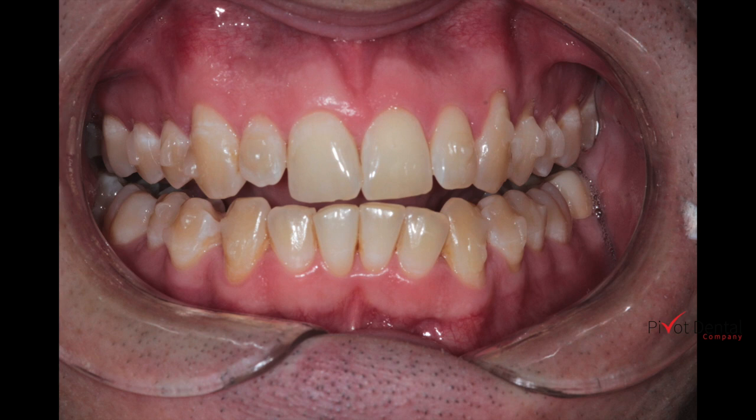It would have been nice to have caught that at the very beginning when going through our ClinCheck — to see the size difference. But it could also have led to a different setup in the ClinCheck to keep that tooth intentionally in place so we could later fix it restoratively to balance out the smile. Hopefully that helps, and I look forward to seeing your comments below. Thanks.